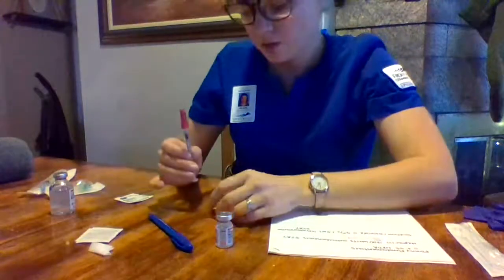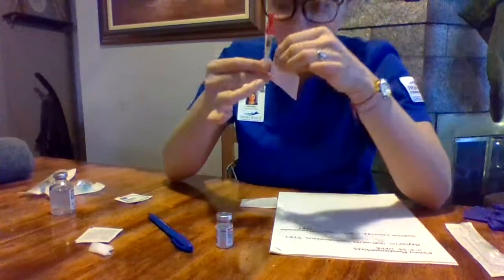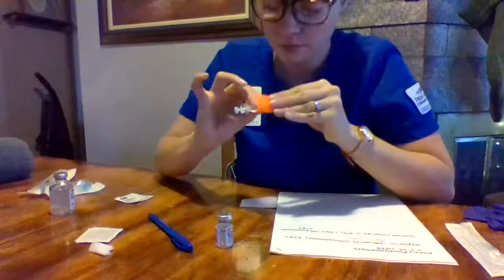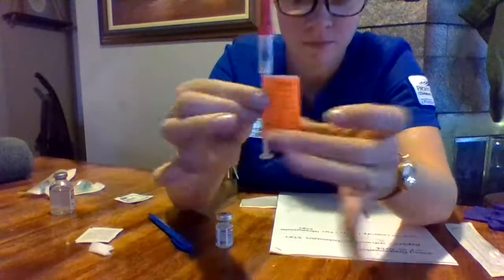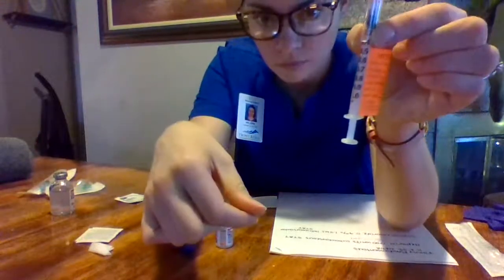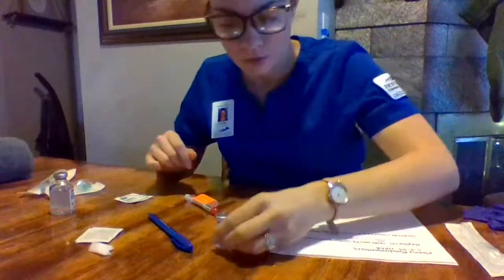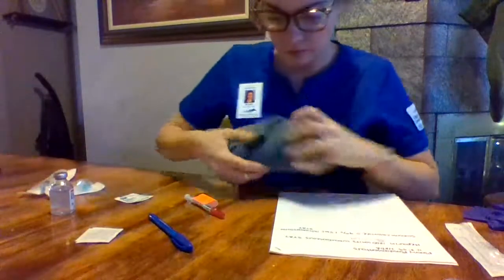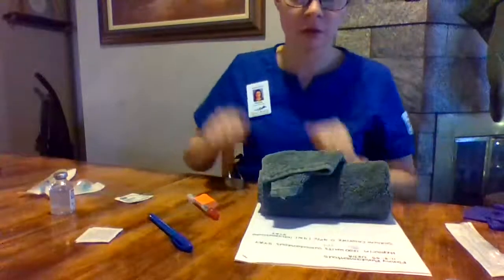Now I'm going to attach my medication label without covering up any of the markings on my syringe. Like this. And then I'm going to head into my patient's room. I will bring my MAR and my medication, knock, wash hands.